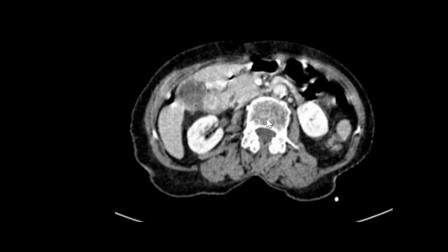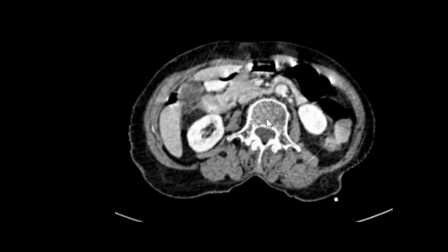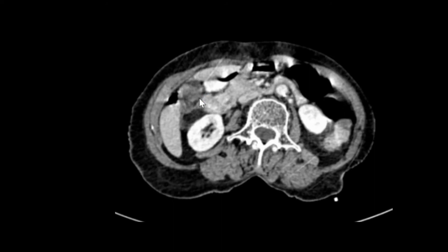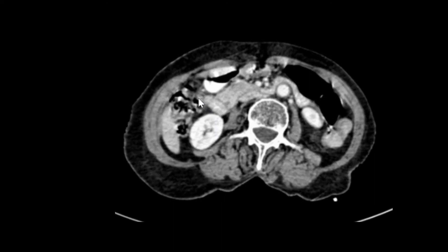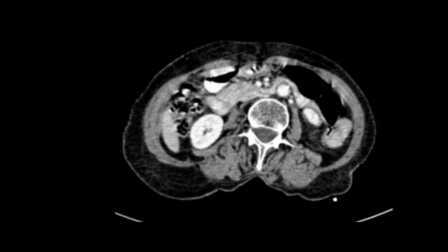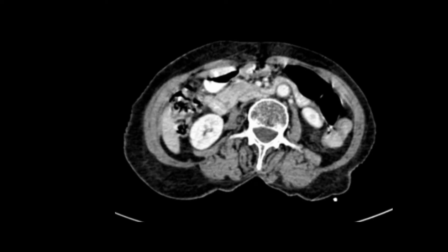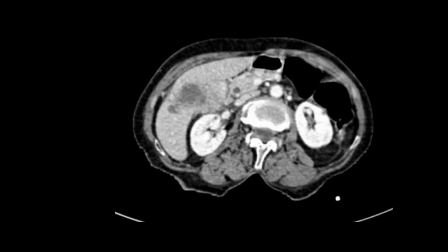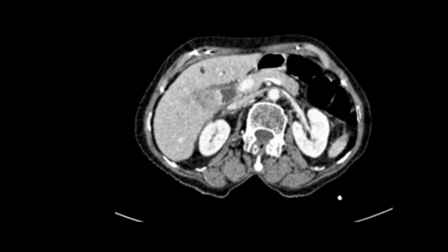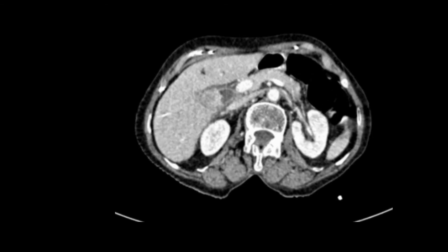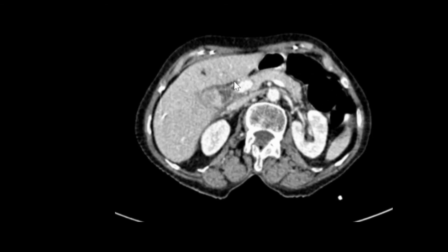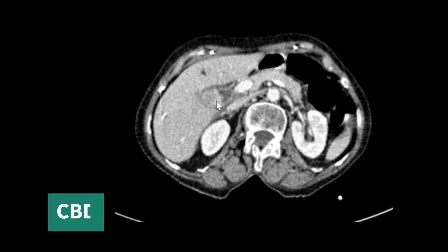As we move down, we can see there is no gallbladder visualized, but there is that necrotic mass itself. Let's go up again to the liver porta. The cystic duct is not separately seen, but the mass is abutting the common bile duct.